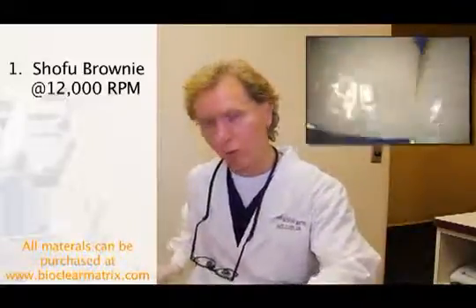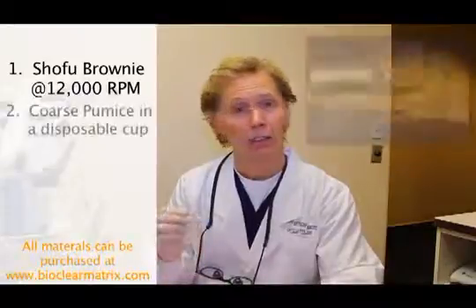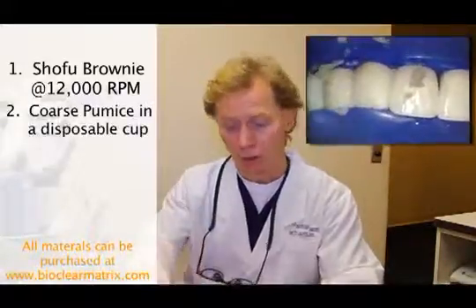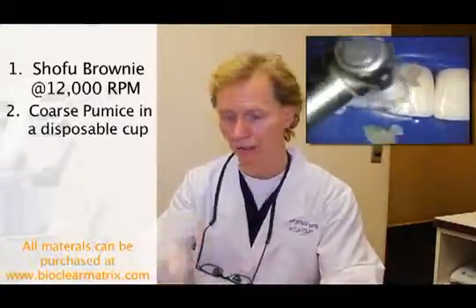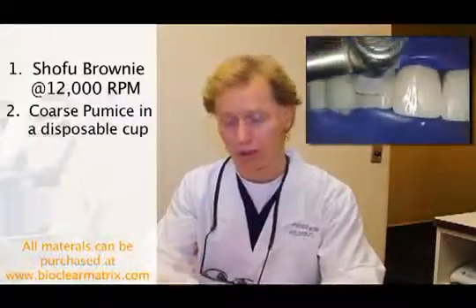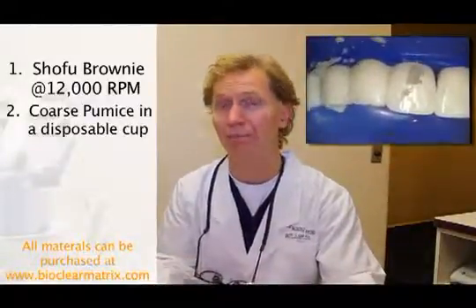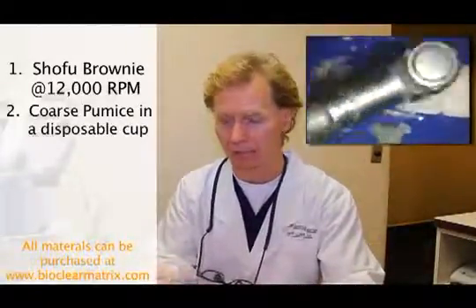Number 2, we want to use coarse pumice in a disposable cup. And that we use very briefly. Make sure and go back to the well every 3 or 4 seconds. If you're running this disposable cup without fresh pumice every 3 or 4 seconds and it needs to be wet, you're just going to overheat the tooth, waste your time, and bake the composite and get that ugly matte finish.